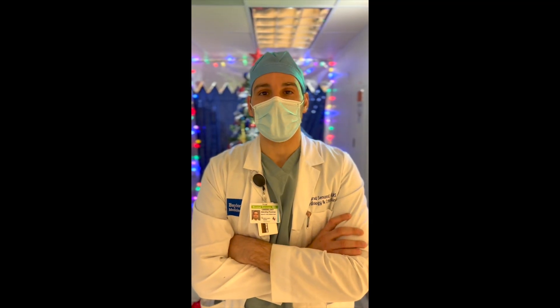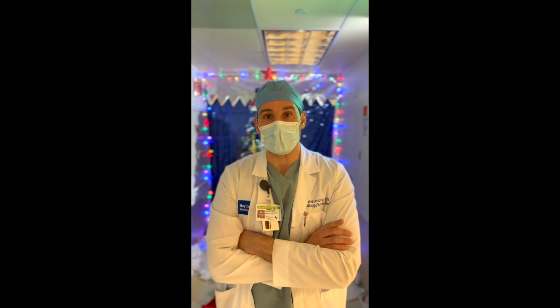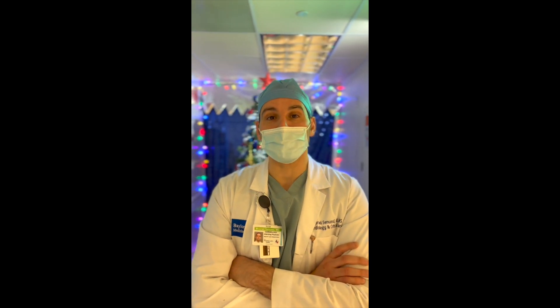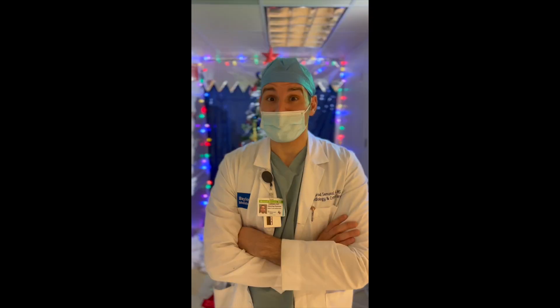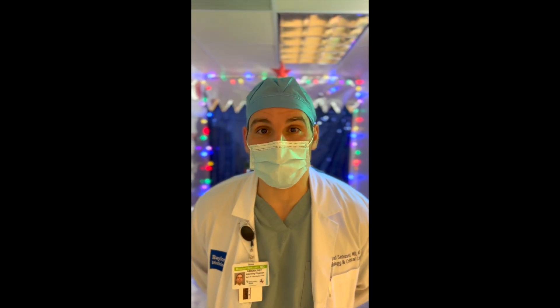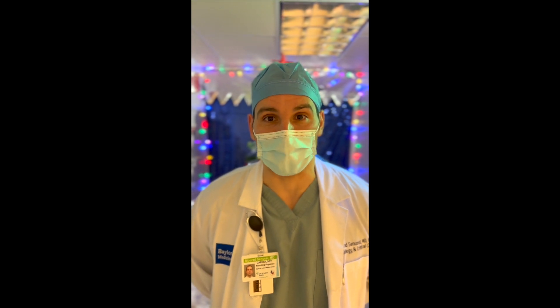To summarize: perform your ultrasound vascular survey using your linear transducer probe to look at both your artery and your vein. Use color flow Doppler to determine the flow in these vessels. Next, use pulse wave Doppler, and ask the patient to bear down or perform the Valsalva maneuver to increase the size of the vein.